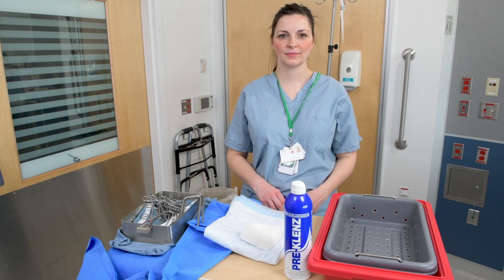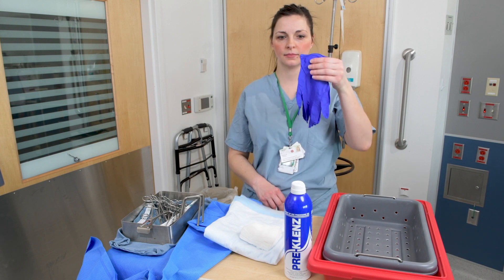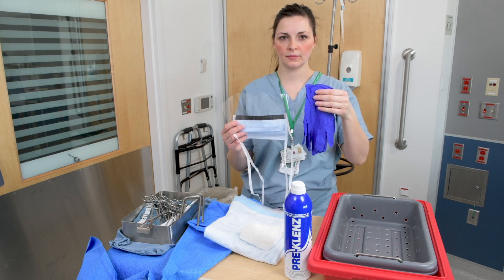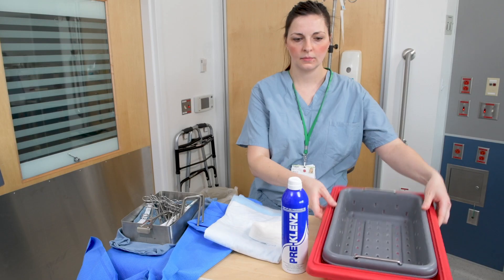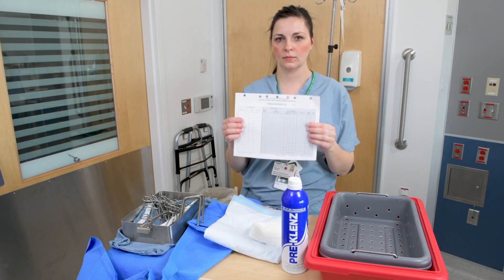The items that will be required for pre-cleaning with a spray include exam gloves, eye and face protection, gauze or disposable chuck, pre-cleanse spray, transport container, and tracking document.